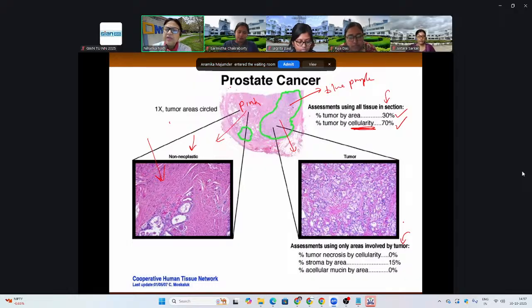It's a little difficult to understand how those are different, but for us, as long as we understand that we have three major ways of looking at it. We're looking at it by mucin, and in the whole tumor, that means they're going by different locations in that tumor, not just this one slide, but going over all parts and over multiple slides multiple times, in different areas. And that's where they find that there is no mucin in totality.